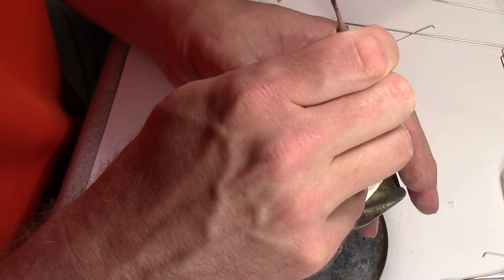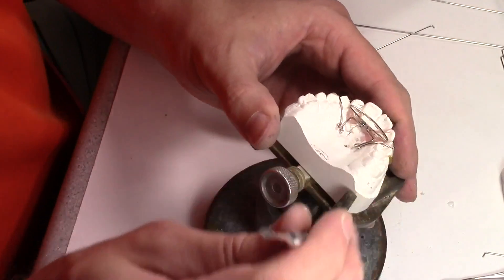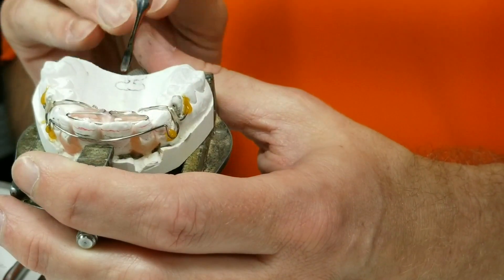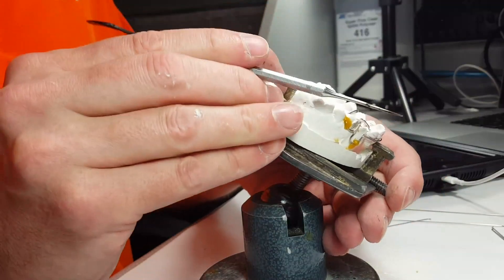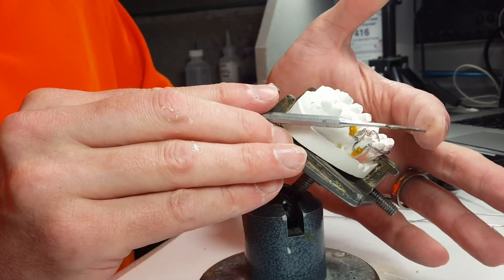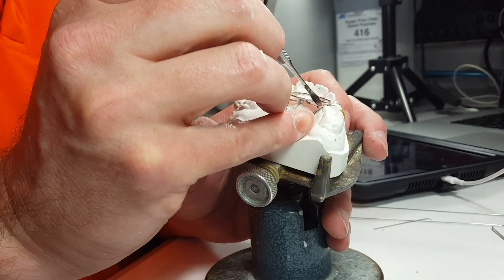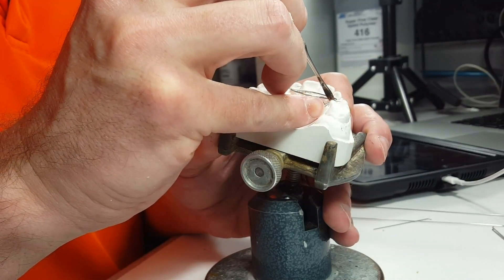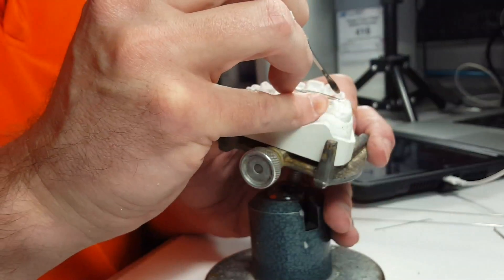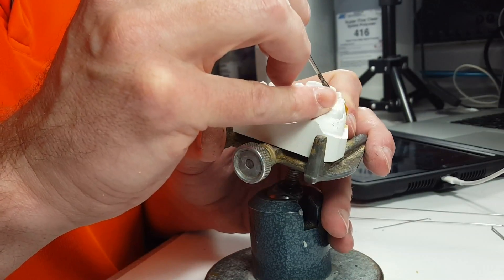Now I know this looks like it's sticking off the palate pretty high, but I really want this angle going straight into the teeth — in this direction toward the teeth. I always want it to push down. If I had it flat against the palate, the spring is always going to try to raise up. So now I'm waxing where I'm going to cut the acrylic — this helps me trim that acrylic easier if I already have it waxed, making a little trench under the acrylic.